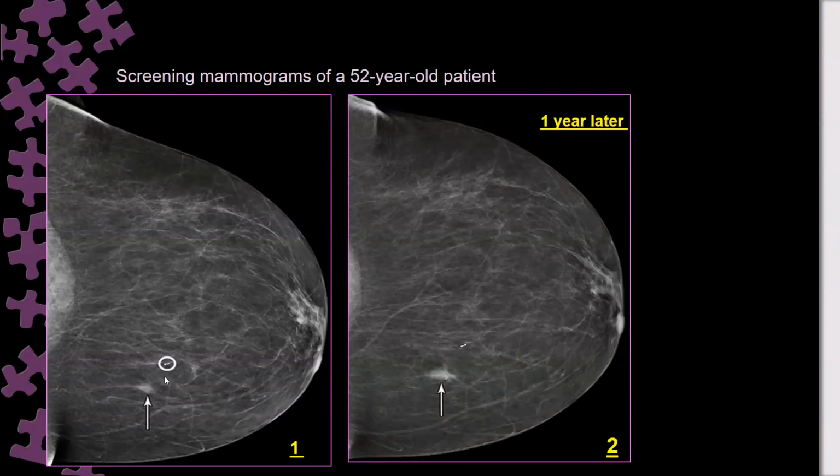you did a biopsy, and this is the tissue diagnosis. A tissue marker, I mean, breast tissue marker. And after this tissue marker, the patient went for screening mammogram or routine surveillance. So what does it mean?